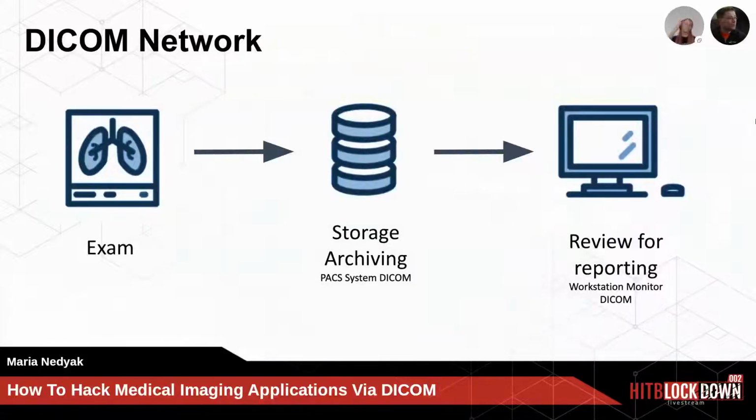Okay, let's move on to the network. The DICOM protocol describes the communication between two devices. Usually it is used between a database, aka DICOM server, and a scan machine, and also between the database and the device where a doctor can analyze the survey.